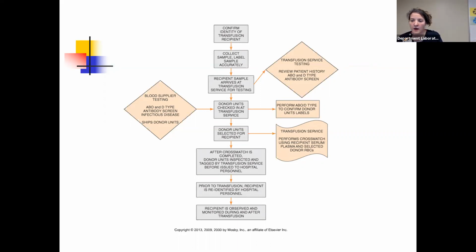Right, and then compatibility testing is going to be performed. Donor units are going to be brought into inventory at the hospital, all right? So they have units that are ready for transfusion. Donor units are selected for the recipient, and then the cross-match is performed.